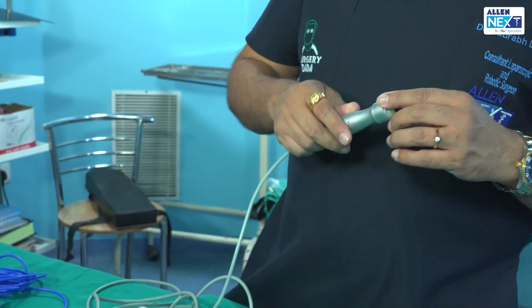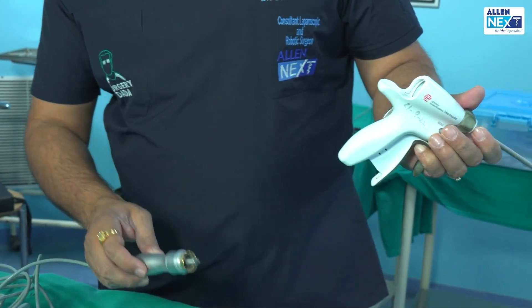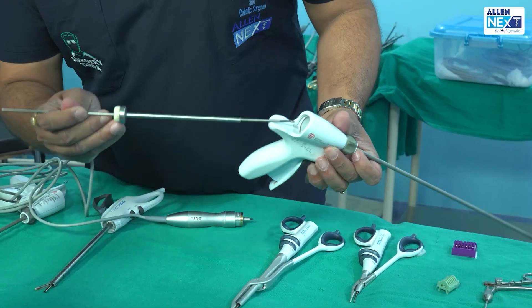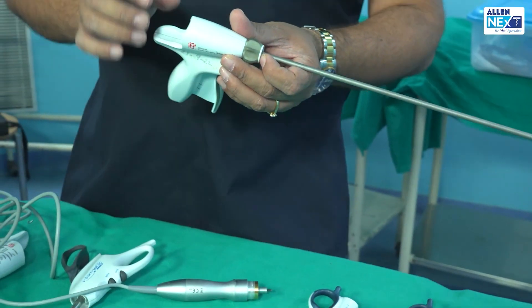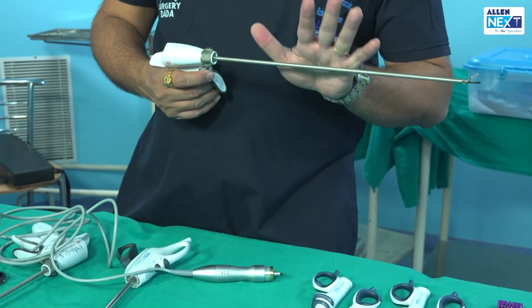How does a harmonic work? It needs an ultrasonic transducer, which is attached behind the harmonic. Can you focus on this small gold-plated ring inside? This is where the sensor mechanism is present.